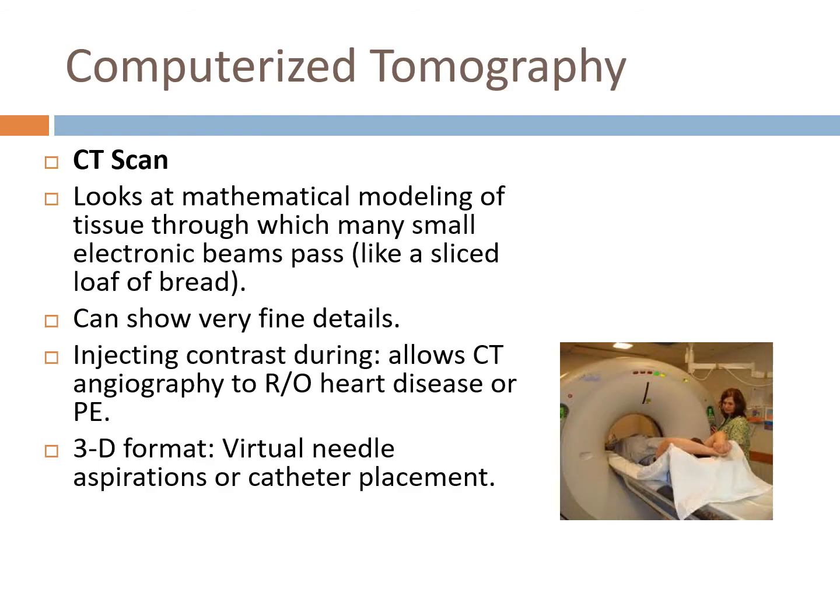Alright, CT scan. CT is someplace you'll go fairly frequently, and it's interesting. I was reading in the textbook about MRIs. It says they aren't done that often. Well, at Good Sam's they are. They seem to take everybody and their brother down to CT for sure, and then even a trip to MRI if they're uncertain what they're looking at.